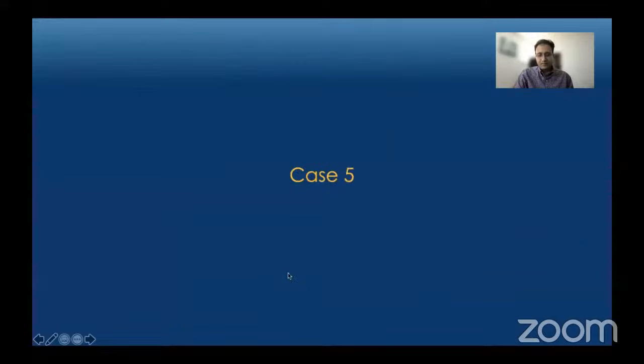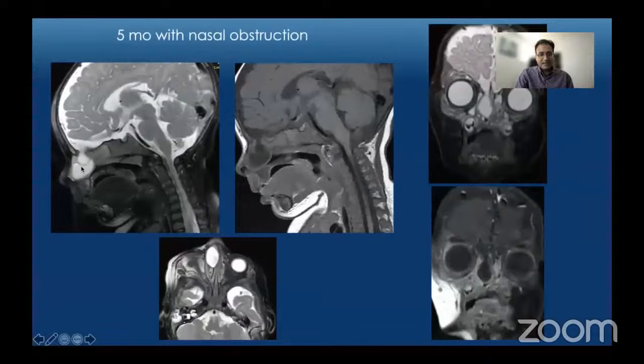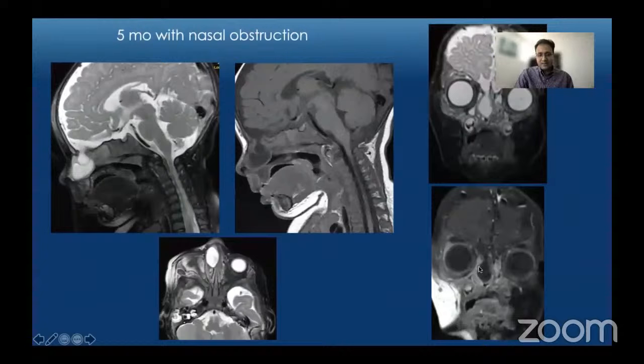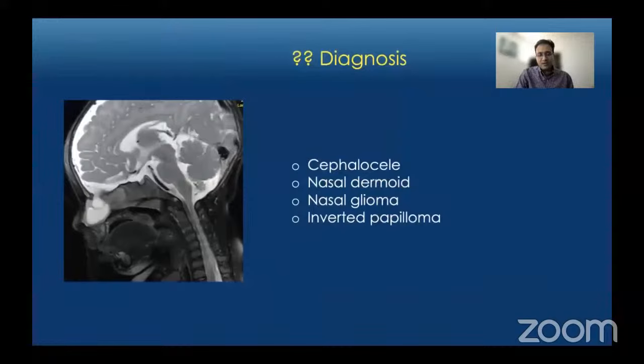The next case is a five-month-old who presented with nasal obstruction. On sagittal T2 and T1-weighted images there is a bilobed mass extending into the nasal cavity. The mass appears to communicate with the subarachnoid space via a defect in the cribriform plate. On axial and coronal images the same findings are seen, and on post-contrast images there is enhancement of mucosa surrounding the cystic mass but no enhancement within the mass itself. The diagnosis is an encephalocele.